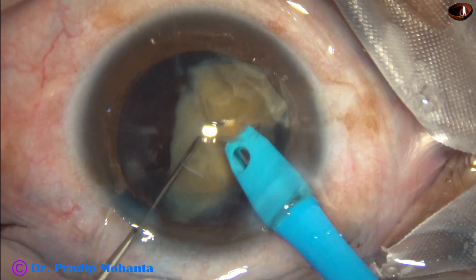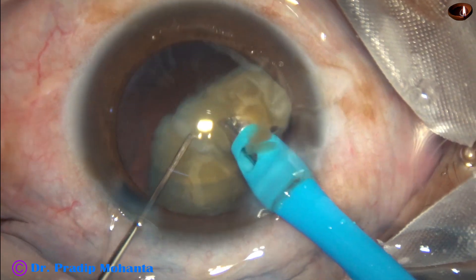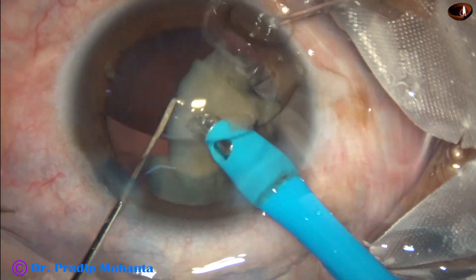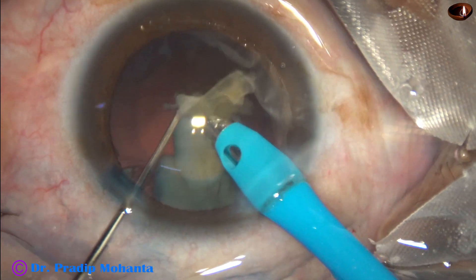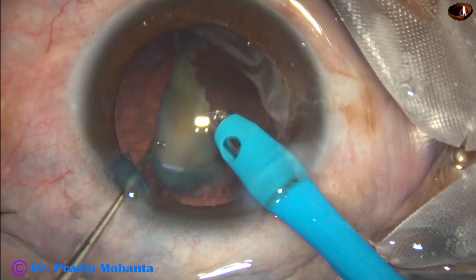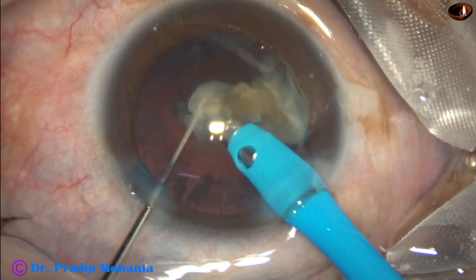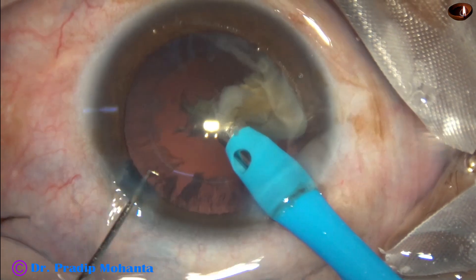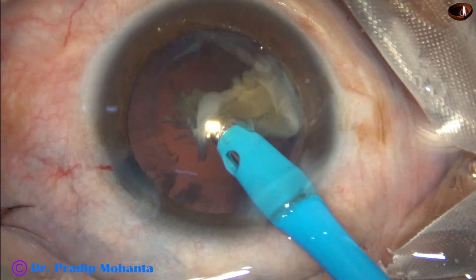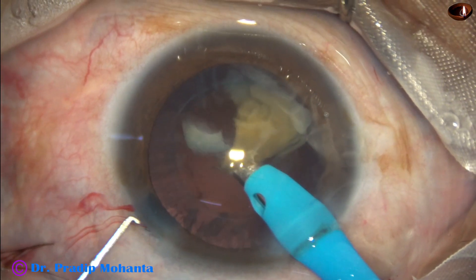These are the last two pieces. This piece is emulsified. The other piece is down and is protecting the posterior capsule. Now I emulsify this space. At this time I reduce the vacuum to 300 and the flow rate to 30.